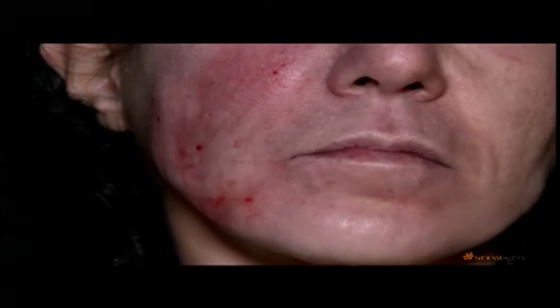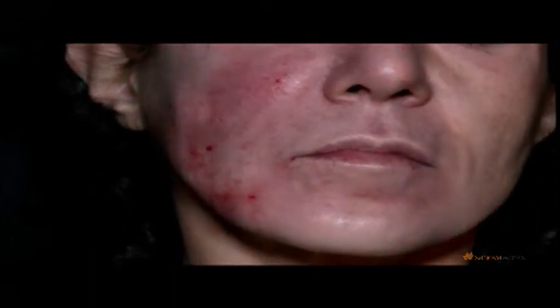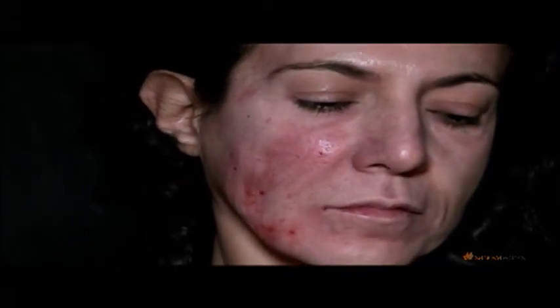What are the other areas where we can use an HA and work multiplane? Well, potentially we can do this for the tear trough area, and this is an area where I do like to use a blunt cannula. I'm using here a 27 gauge blunt cannula, and I'm just going to show you basically how we make the entry hole. I'm going to clean off the area first of all.